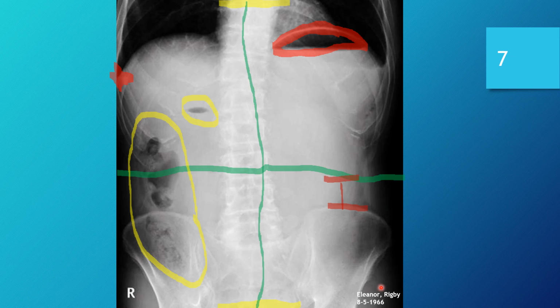Number 5, does the image demonstrate appropriate reference information? Well, we have, once again, an anatomical marker, which is great. We're wanting to see those. It's unfortunately not a complete anatomical marker. It doesn't include the technologist's initials, and that is pertinent.